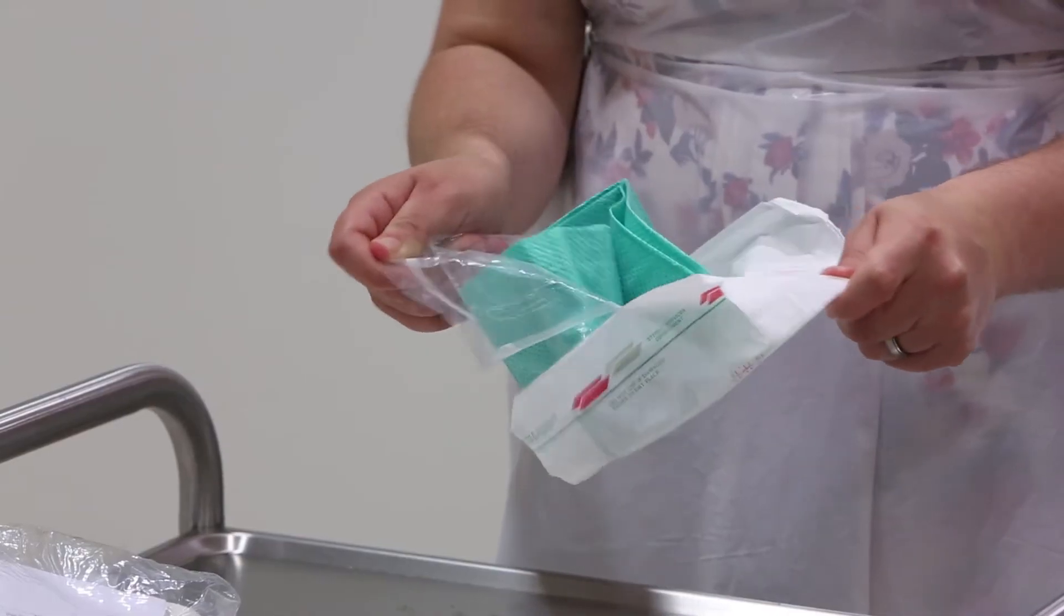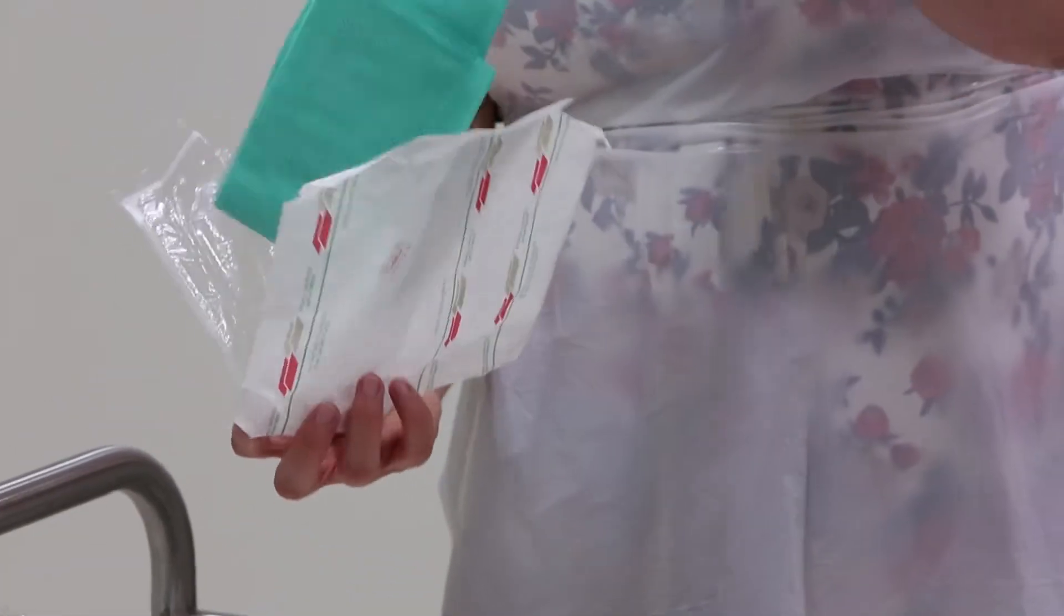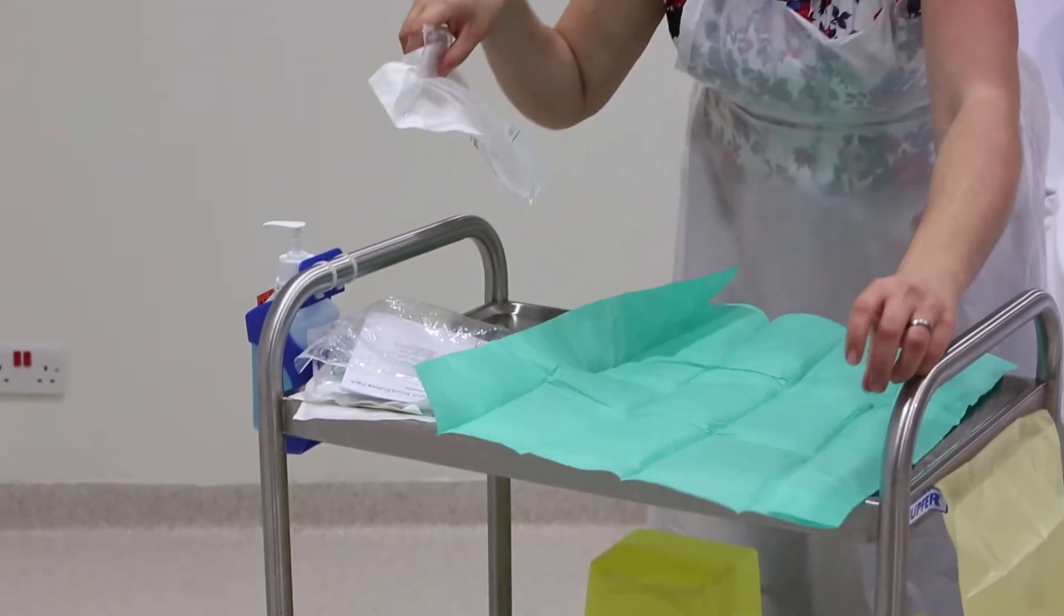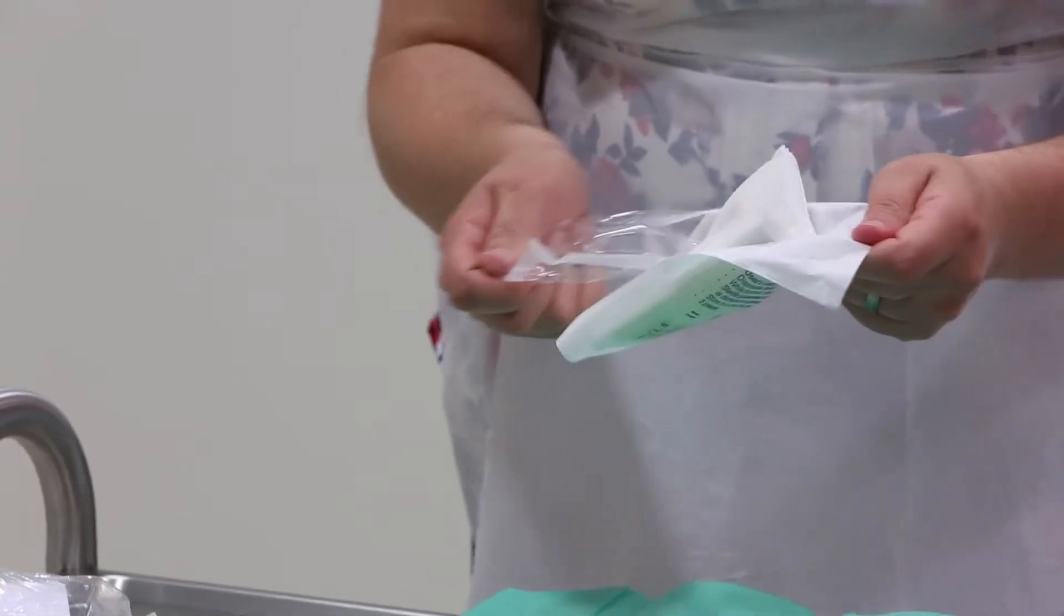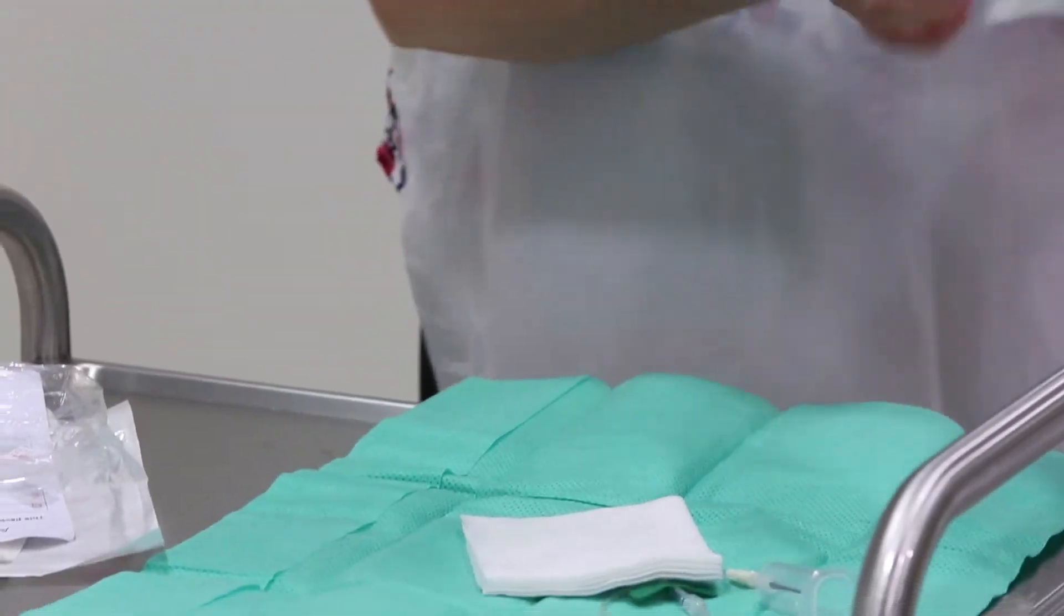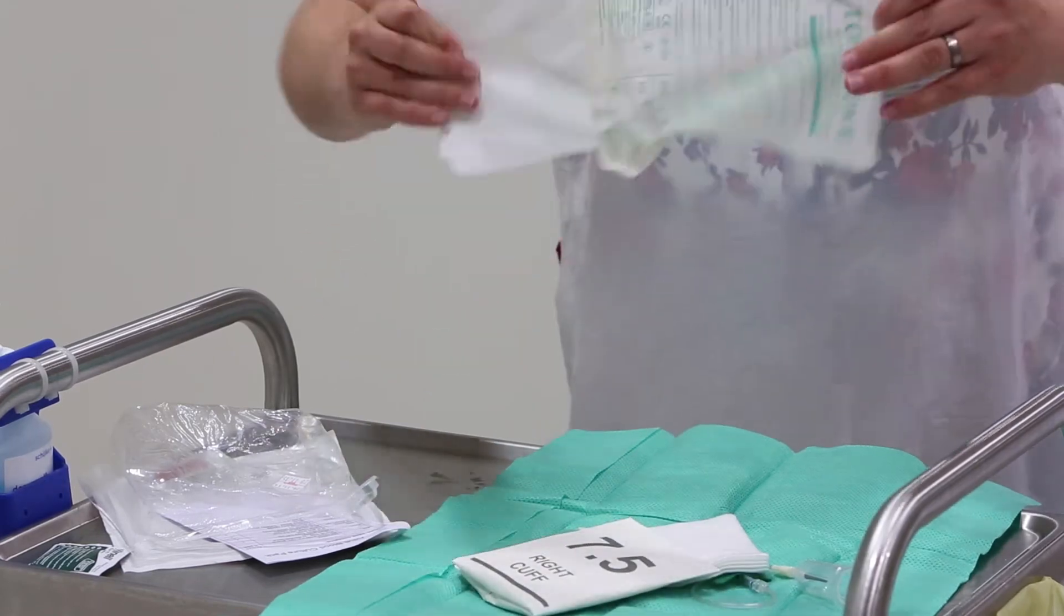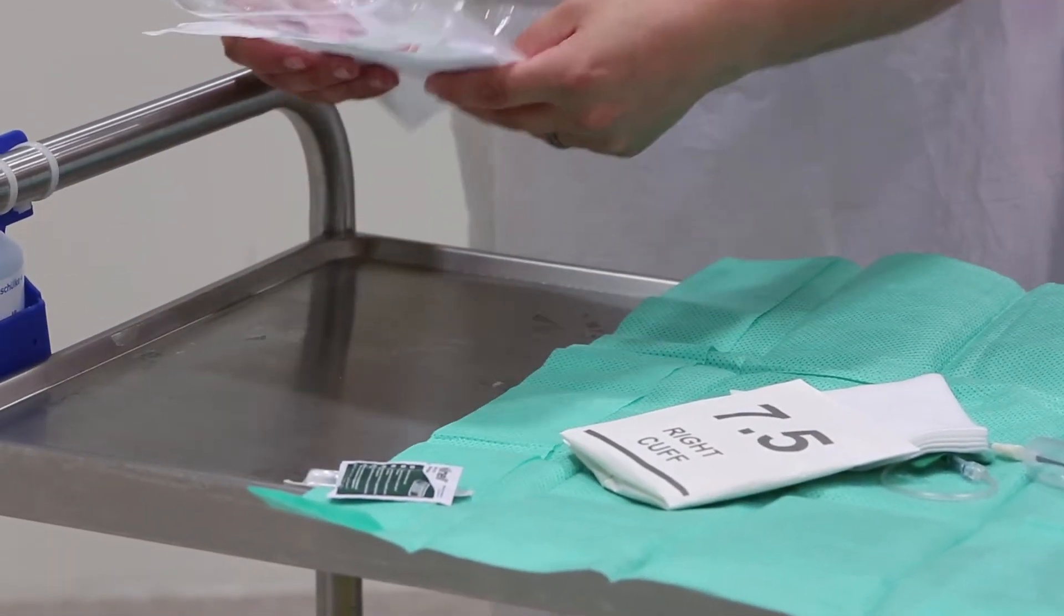Carefully open the sterile towel onto your work surface by grabbing it at the edges, making sure not to contaminate the towel whilst doing so. Open each piece of equipment except for the chloraprep applicator and the chlorhexidine and alcohol wipe onto the sterile field, once again taking care not to contaminate the sterile items whilst doing so.